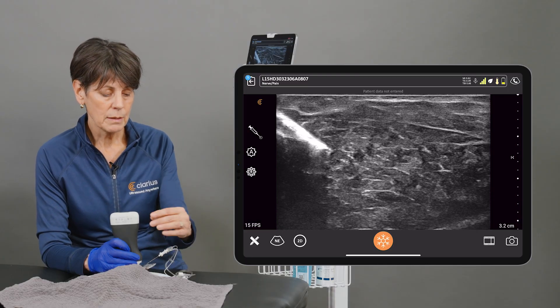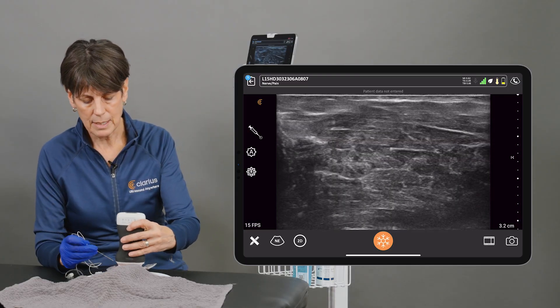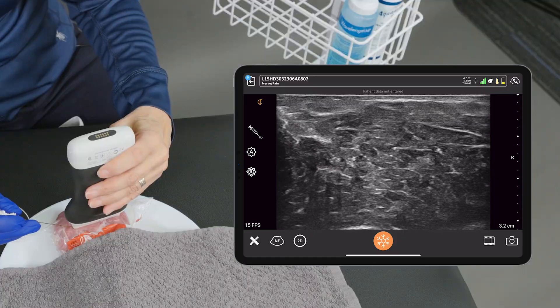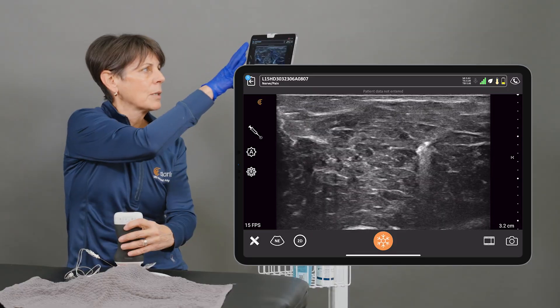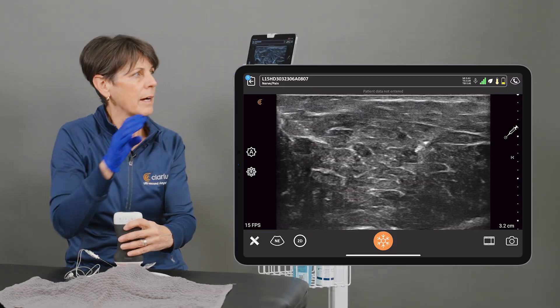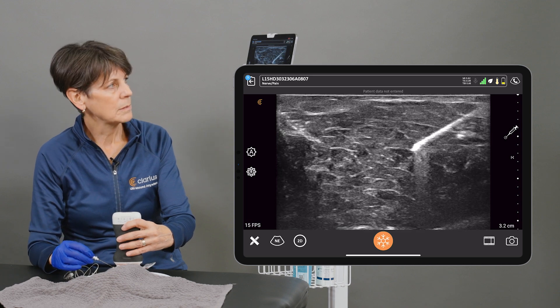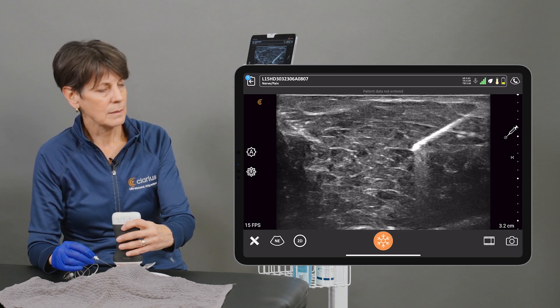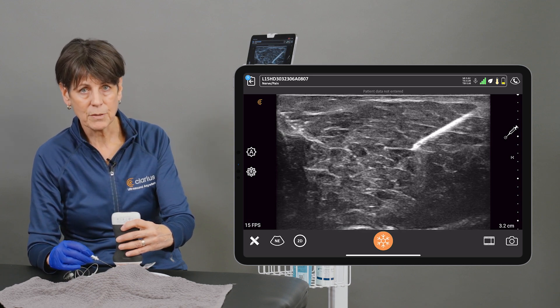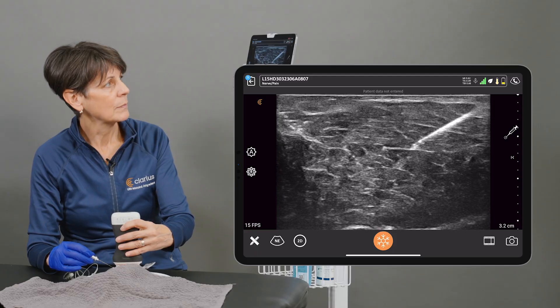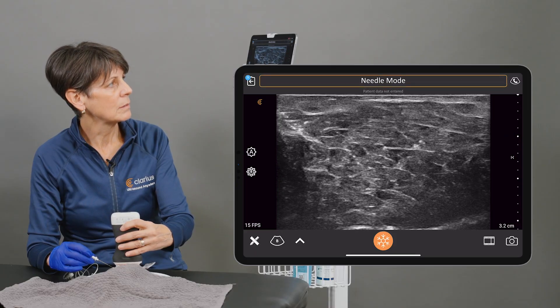Now, if you're doing an injection on the opposite side, you just need to tap the needle icon to tell the app that you're entering from the other side of the scanner. And again, Needle Mode — off.